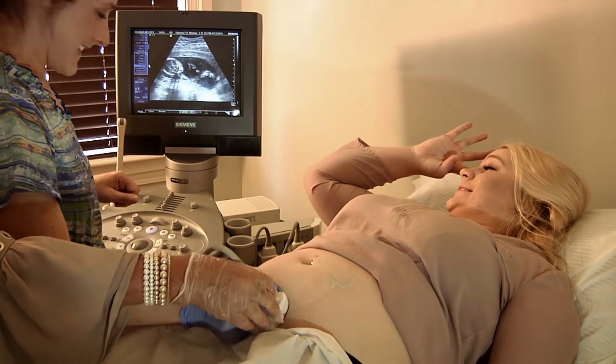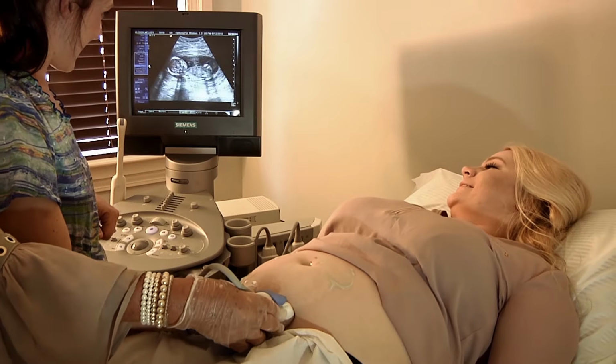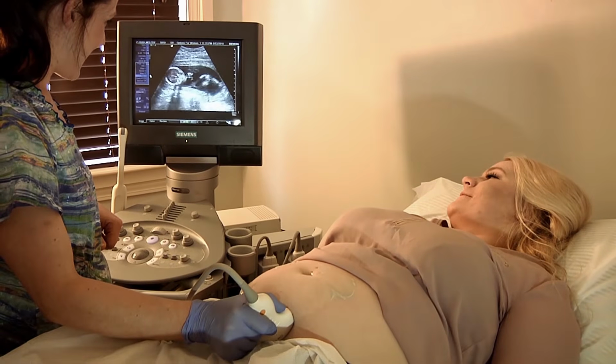So that means it's playtime. Let's see what you're doing in there. Come on. Give her a kick. Give her a kick. Look at the hand.